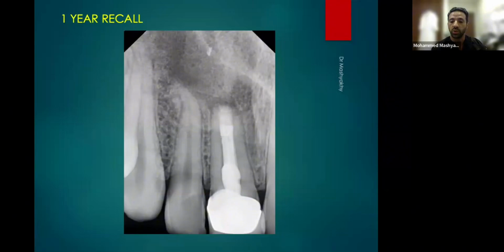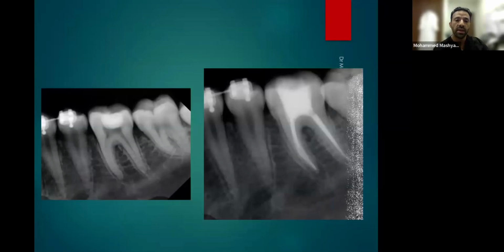So having a good obturation is one of the keys. If that case had a good obturation from the beginning, we would just do the surgery and we would be trusting our conclusion. But in a case like this, I know there is infection inside, I know it's a very poor obturation, but there is no other option in this patient.